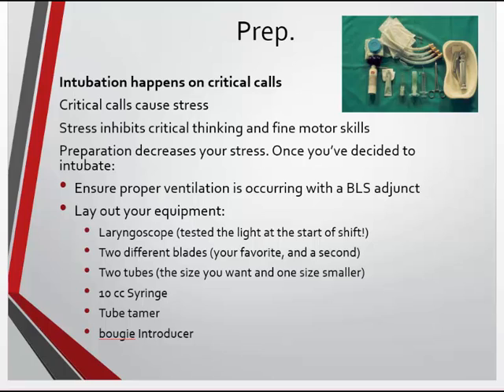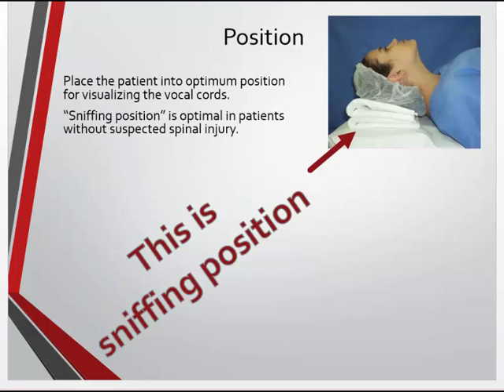That preparation is going to help you decrease your stress, and you've heard of muscle memory. If you play a musical instrument, muscle memory is when you do the same thing over and over again, your muscles just naturally go to those places. If you practice this, if you have a setup that you do before you tube, then that's always going to be the same for you, and you're going to be able to fall back when you're nervous or stressed or having a difficult airway intubation. You can go back and have your equipment right there, and it's right where you need it, so you can decrease some of that stress.